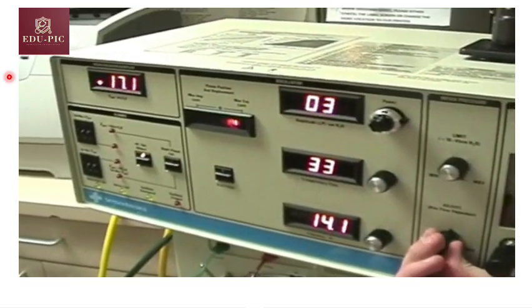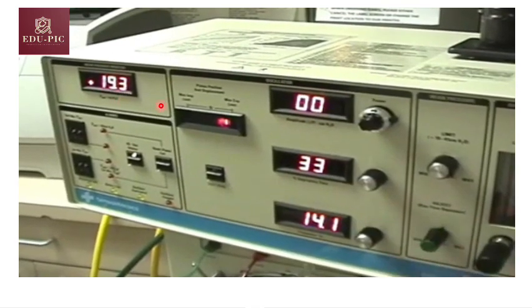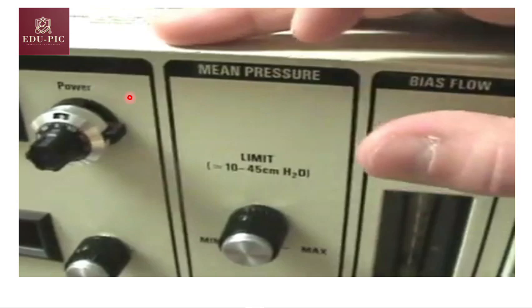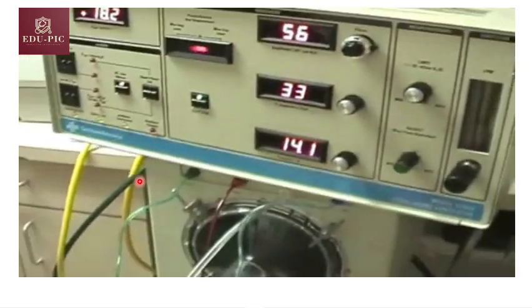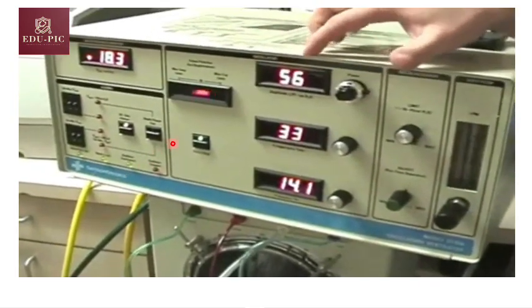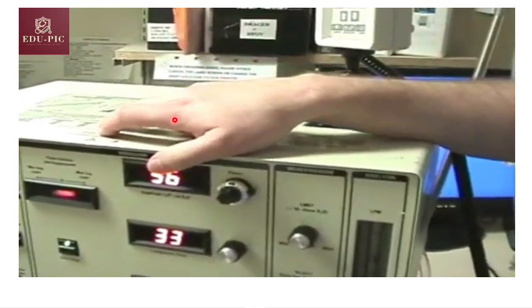Here is a start. We will decrease the MAP here from this button, and you will see this monitor, it is decreasing, it's going down. This is a MAP. So let's start with a MAP of 19 to 20. These are the initial settings for a neonate now. And here is the power or amplitude or delta P. We'll set from here. We'll start the ventilation now.